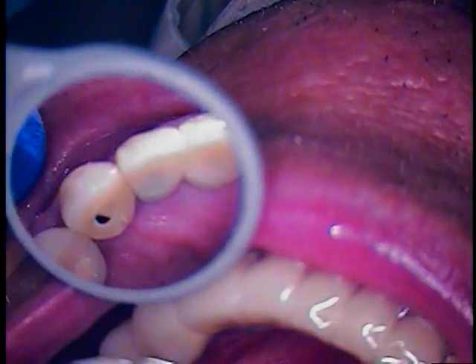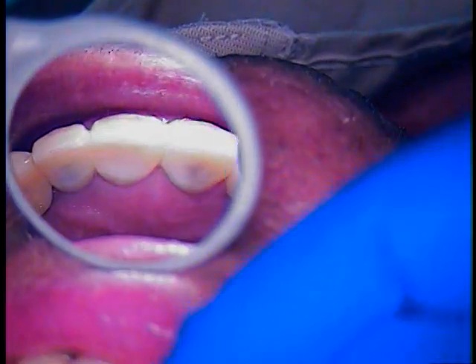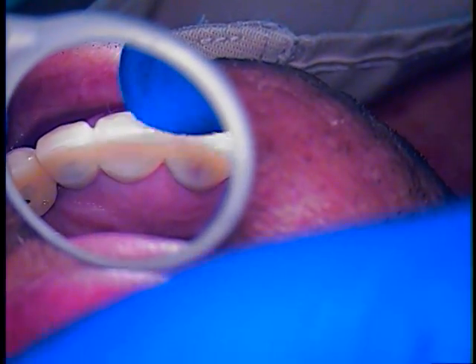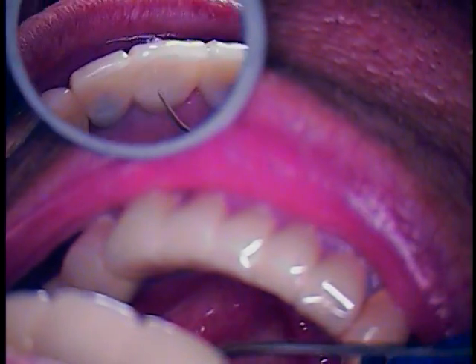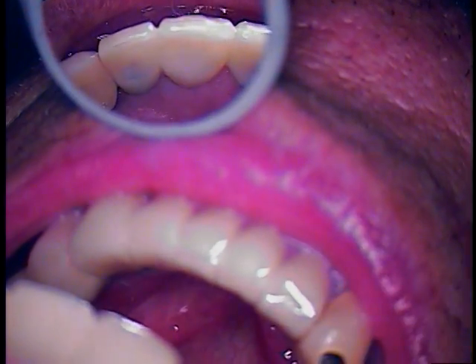Tooth number 11. We saw our patient not too long ago. He had a loose anterior bridge that was placed within a year. It fit the teeth pretty well, but the problem was his occlusion. He had more of a flat lingual surface — the lingual aspect — and it was causing occlusal trauma, pushing the bridge forward. So we made these a little more concave, gave him a better protrusive path for his bite. So now that's pretty solid. It's been re-cemented, cleaned up with the microscope and re-cemented.